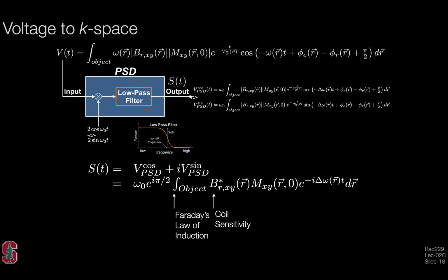We, of course, want good receiver systems, so we typically want this component here to be high, and we pay a lot of money to have high-performance coils so that we receive as much signal as possible. This transverse magnetization, of course, contains the image contrast information that we've arrived at after a series of, say, RF pulses. And that's at the time we begin our image acquisition or signal reception. And of course, that signal is going to decay a little bit with time, and that term is dropped out at this point, just to focus more on the spatial frequency encoding term, which is the last term shown here.